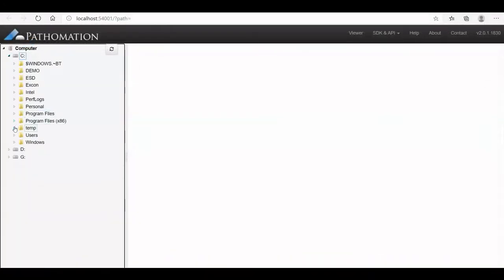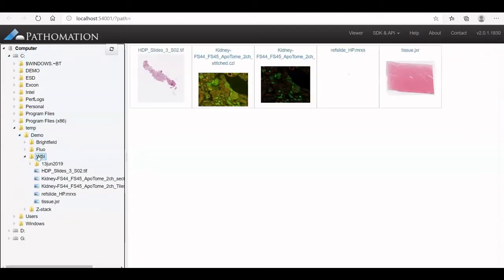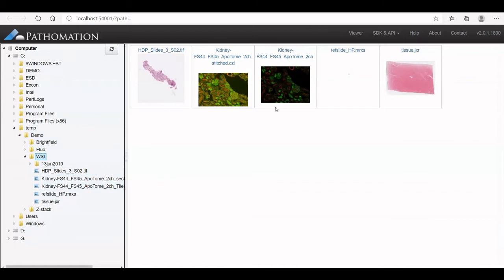To open a whole slide image, you go to the tree on the left. When clicking on a folder, you receive an overview of all slides in that folder as a list in the tree or a tile-based overview in the viewport area.